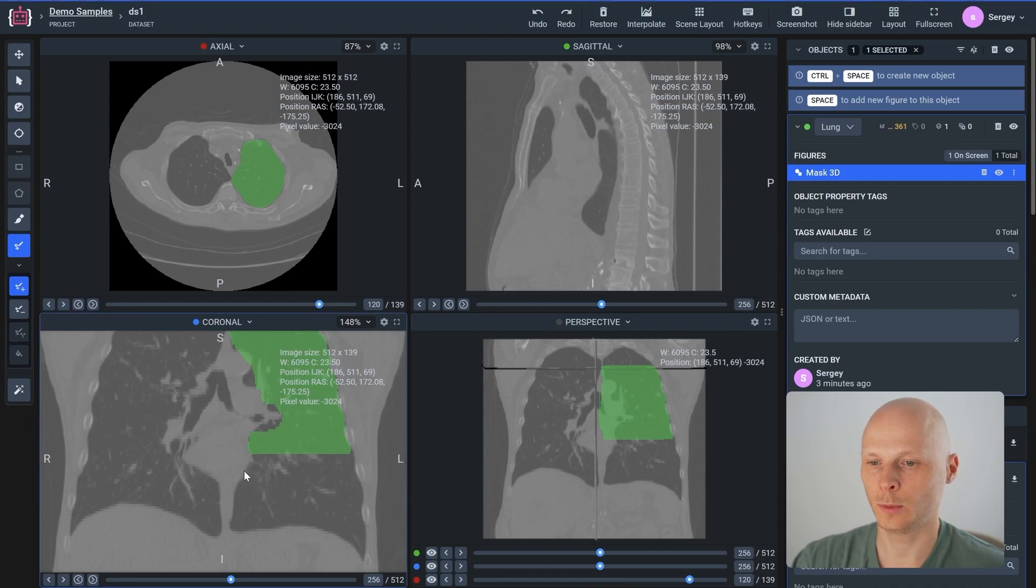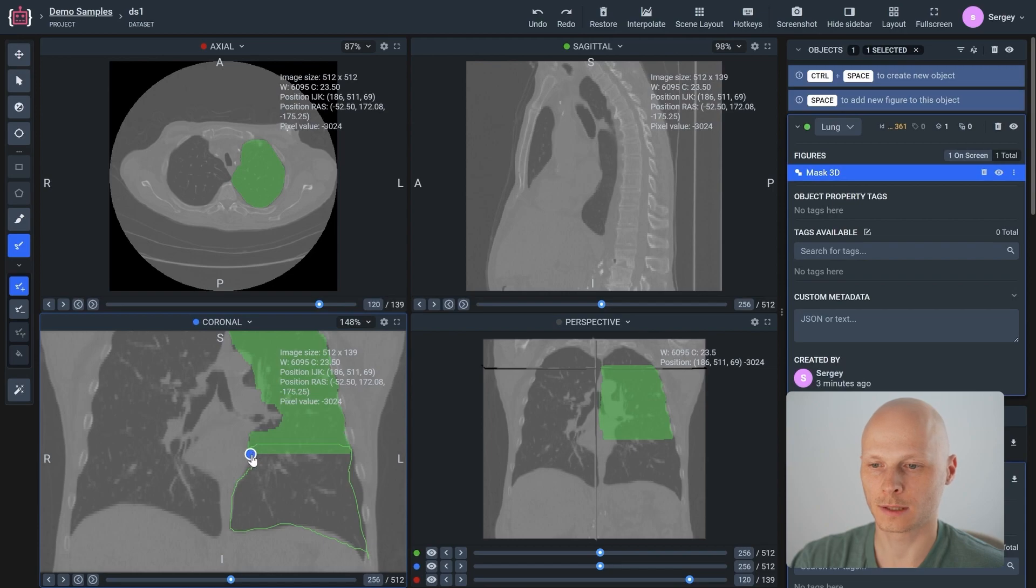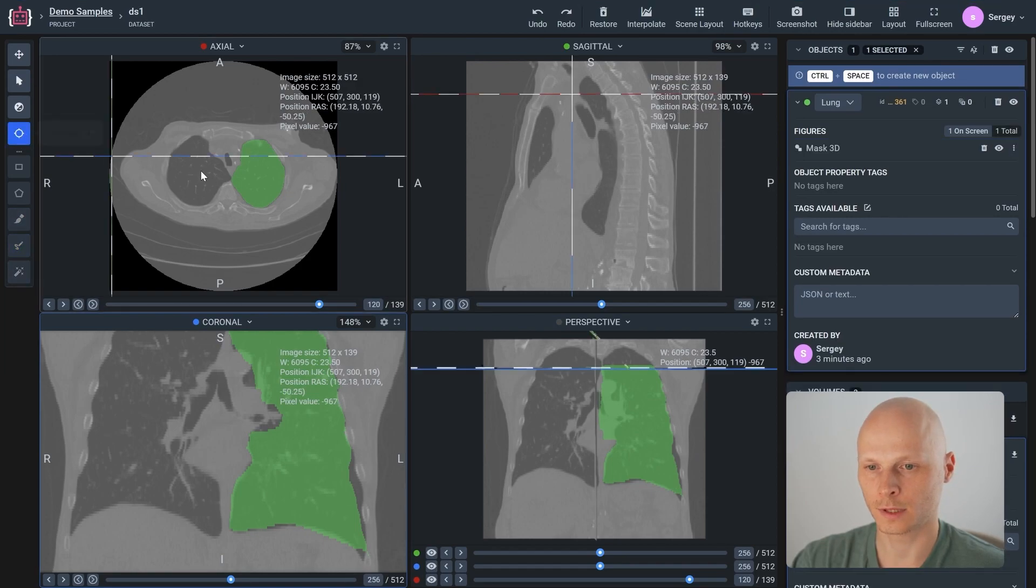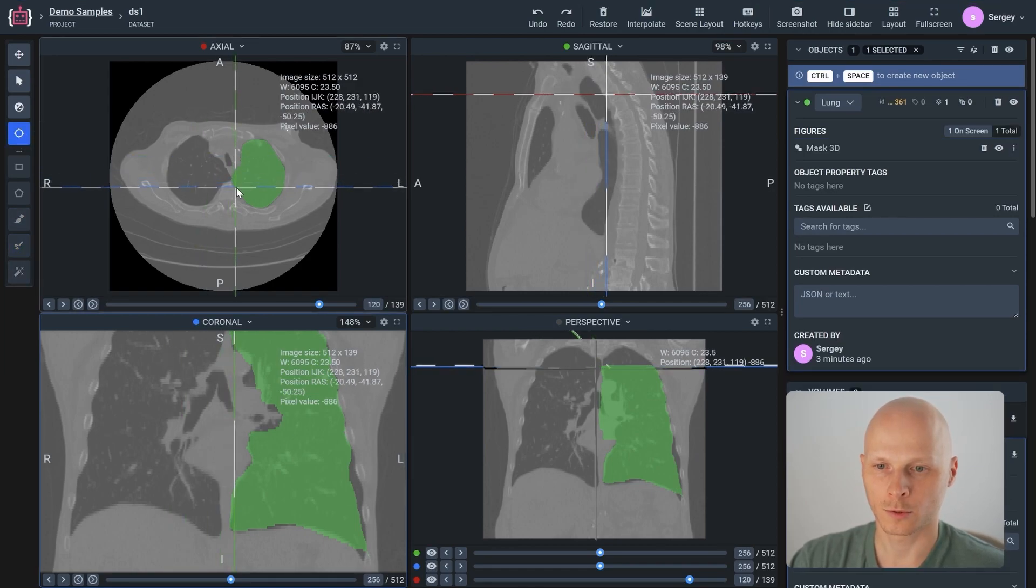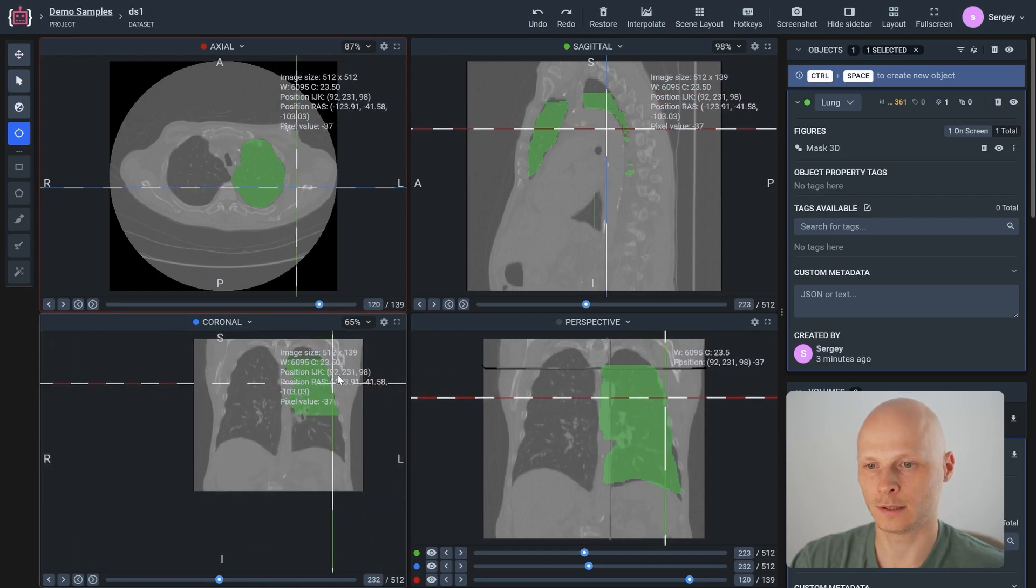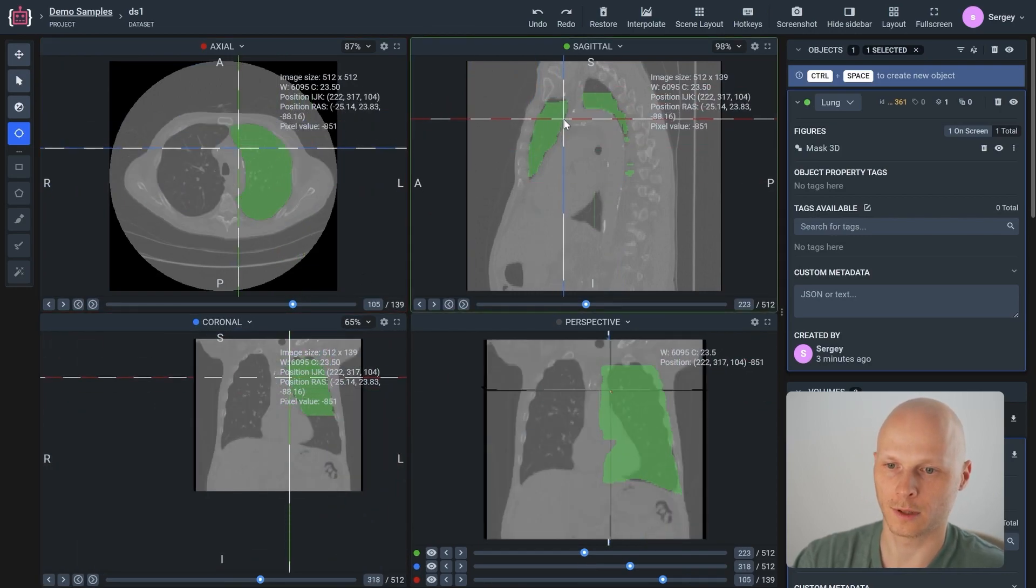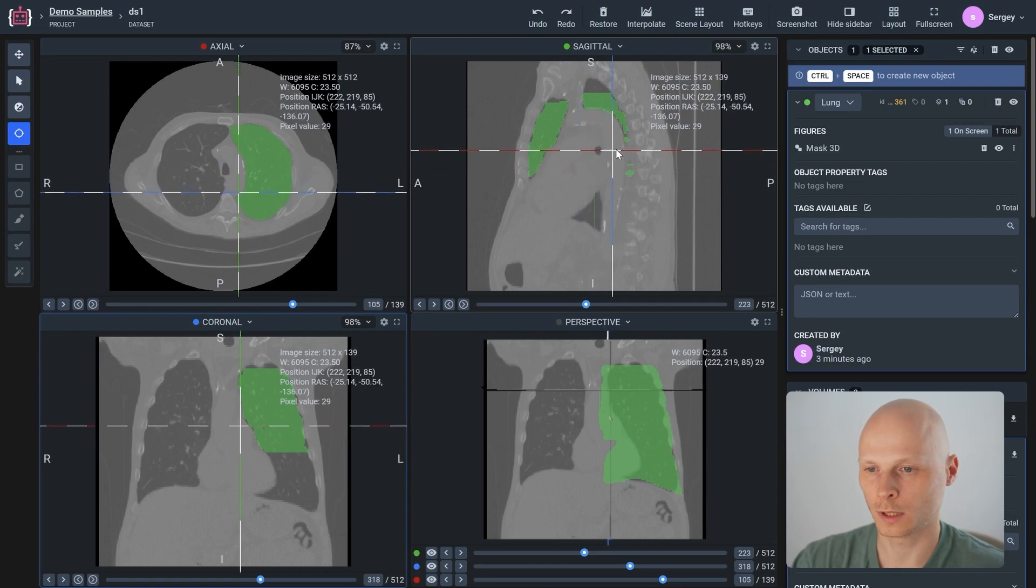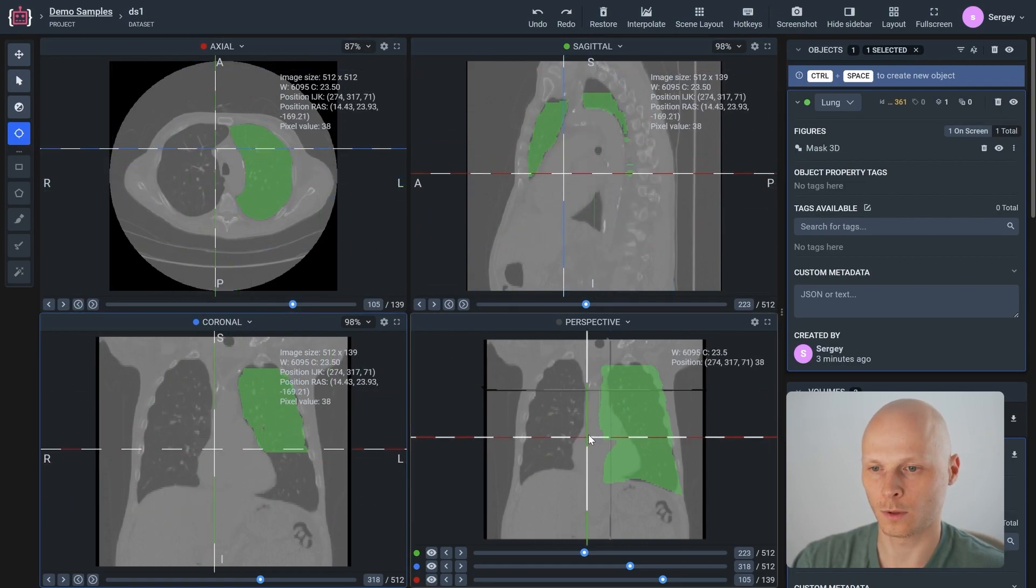Additionally, we can select the object and correct the results on different planes. Supervisory works directly with 3D data. We also have additional features like the crosshair tool that allows to quickly pick a point on the volume and see the corresponding location on other planes. With this tool, you can navigate quickly across all planes in the volume.